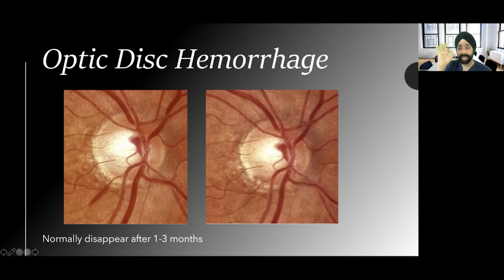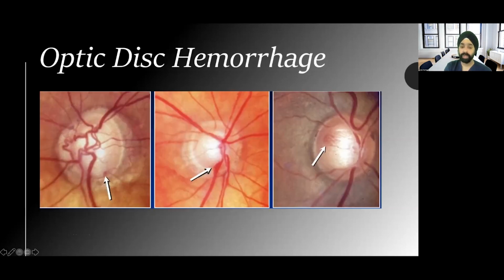And that's why I use my 90 diopter lens. Every time I see a patient, every 4 to 6 months, I'll at least take a quick glance at the nerve to see, am I missing a disc hemorrhage that I could identify? And that's a patient you have to say, hey, maybe they're not controlled quite as well.